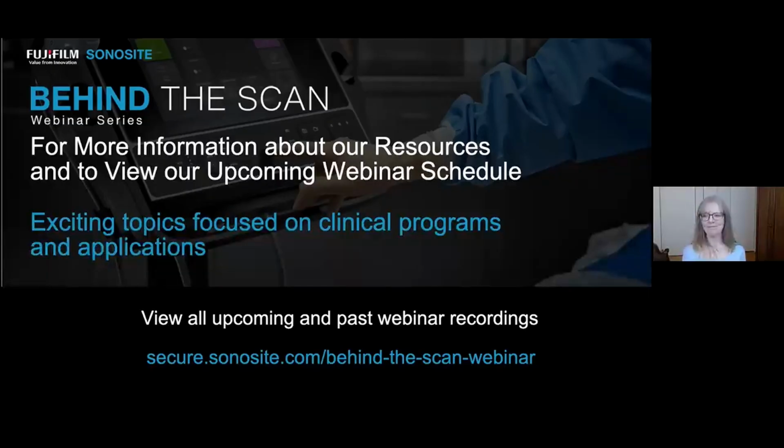Great. All right. I have a couple questions on how do you turn on the needle guide? The guideline down the middle of the screen. Well, it's dependent upon the model that you do have. You're either going to use guideline if you want to have distance between the dots captured, or you can use center line. So simply pressing that button starts it, and pressing it again stops it.